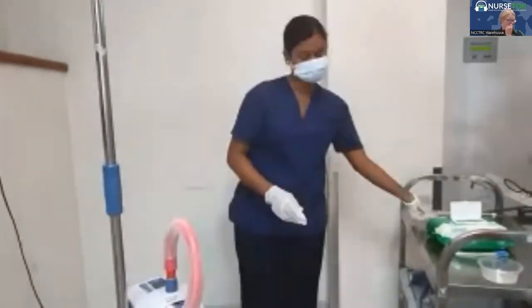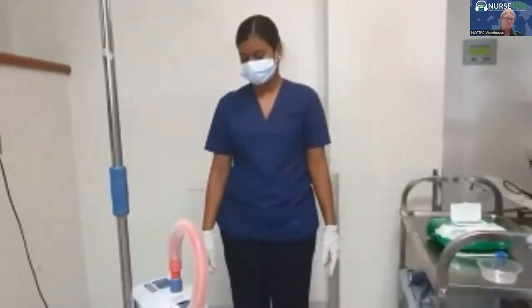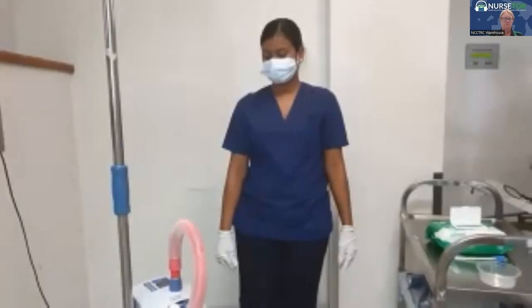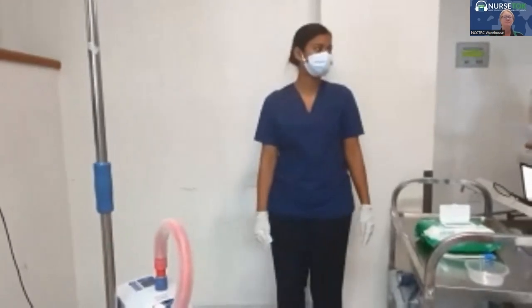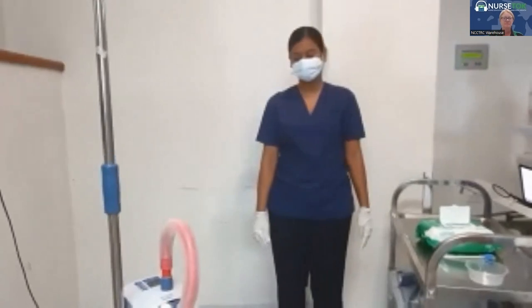Once we've connected the disinfectant tube, the machine will now automatically start the disinfecting cycle, which takes about 55 minutes. Again, if any problem occurs and the machine stops disinfecting, you can always restart the cycle. And if the machine keeps stopping repeatedly, you can always notify the biomed technician. So once the disinfection is successfully completed, it will show the disinfectant cycle.